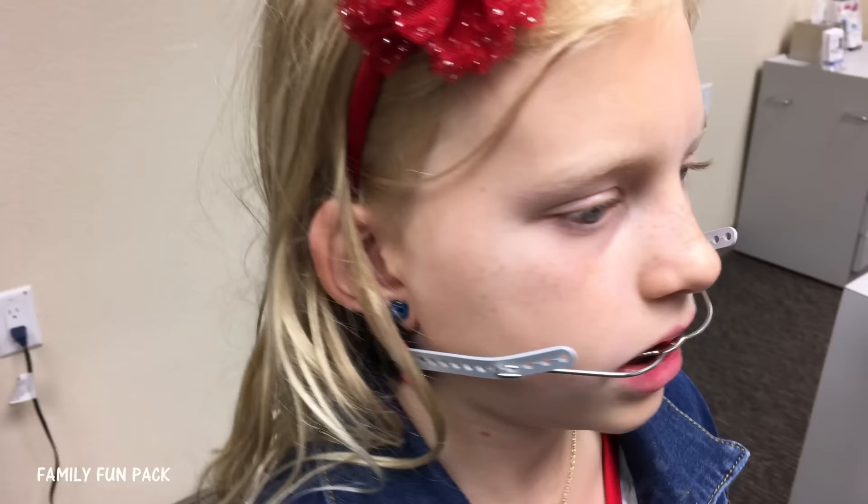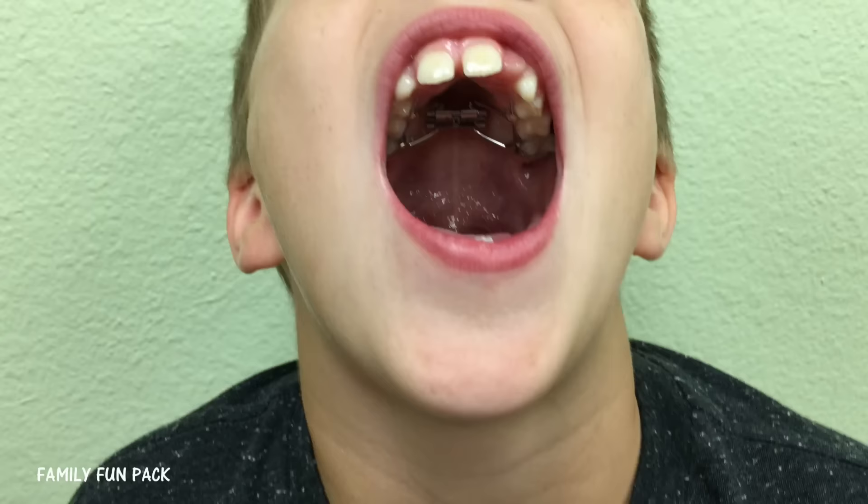So it's kind of holding it there so this can catch up. How is it? Good. Sort of good? Yeah. I don't know if I'm believing you on this. At least your strap's cute. I can't make my head go up. Feels weird? Yeah. I like your pink strap though — your strap's pretty cute.